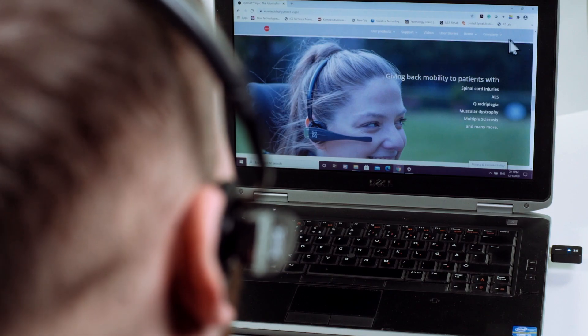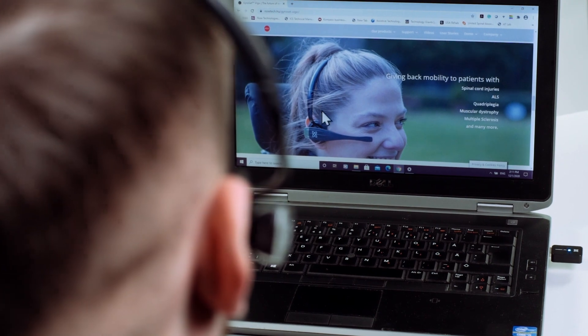You can recenter in three ways: you can get an assistant to deactivate then reactivate the VEGO headset by simply pressing the silver button on the side once; or you can manually realign the center position by using the sides of the screen; or by deactivating and reactivating with the headrest sensor or external switch if you're using the VEGO to drive your chair.